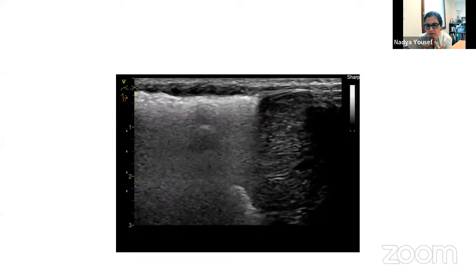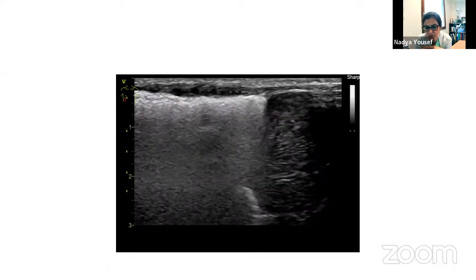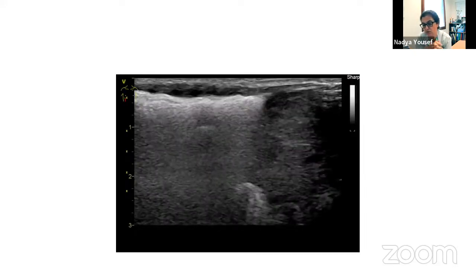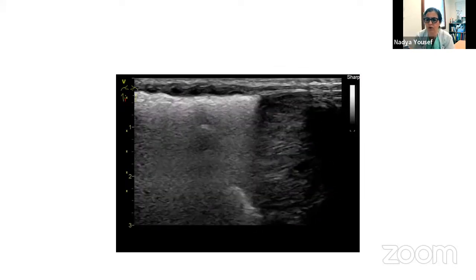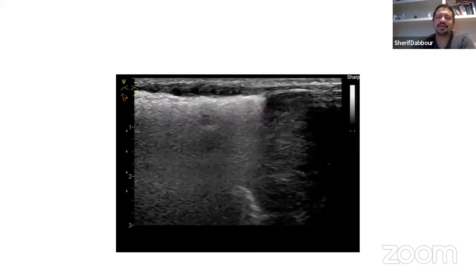Somebody asked whether we would see better with a higher frequency. Of course, the higher the frequency, the better image you get, but is it really necessary for the lung? Not necessarily. It depends on what you're used to seeing. I'm used to seeing images with a high frequency, and in the small newborn, you're more comfortable above 10 to 12 megahertz. But this does the job, right? Yeah. That's great. Thank you very much.